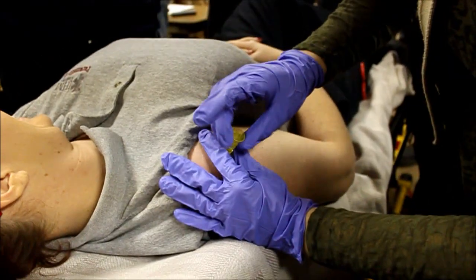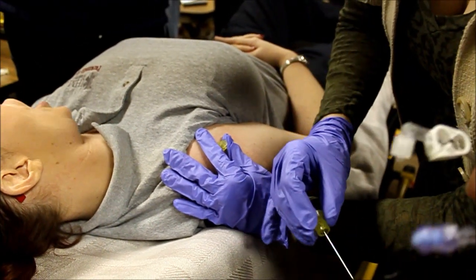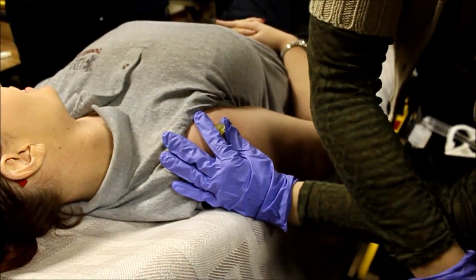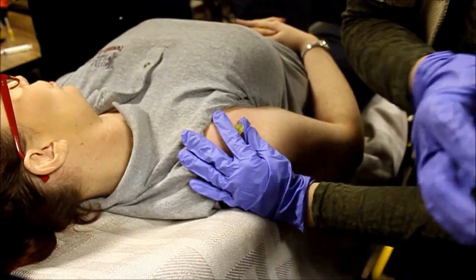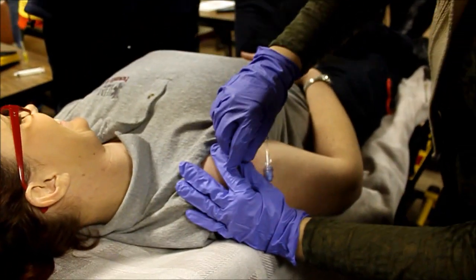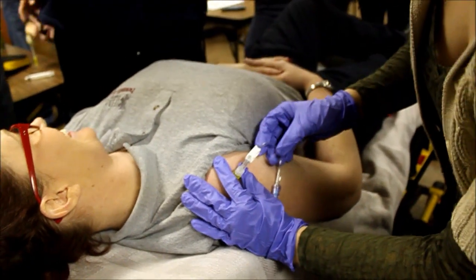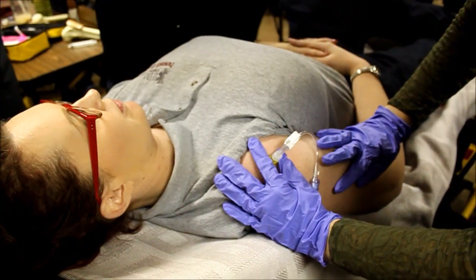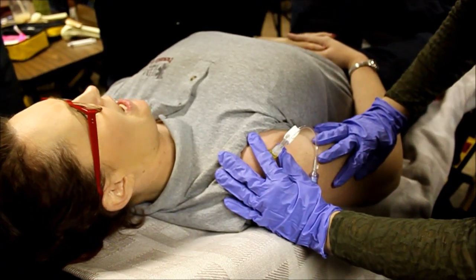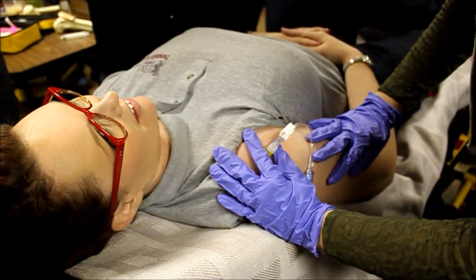It's a tough act to follow right there. It's awkward — yeah, it feels just weird. You're touching something that's never been touched. From zero to ten, ten being the worst pain you've ever had in your life, how bad was the insertion? Four, maybe? I think it's the awkward level, the creepiness of it.